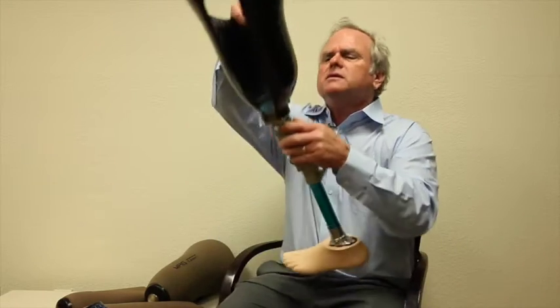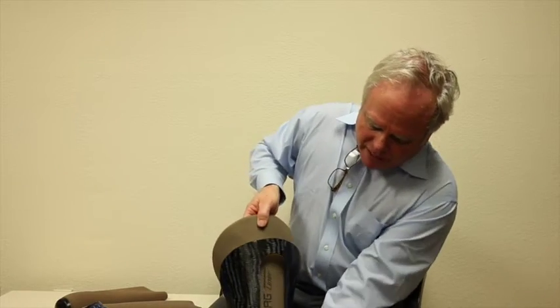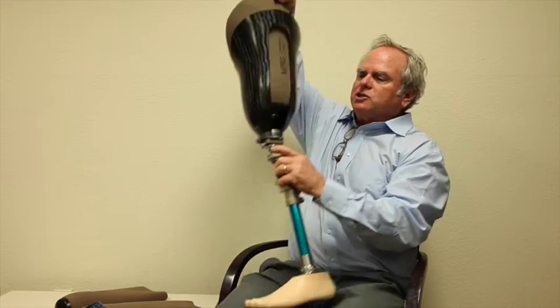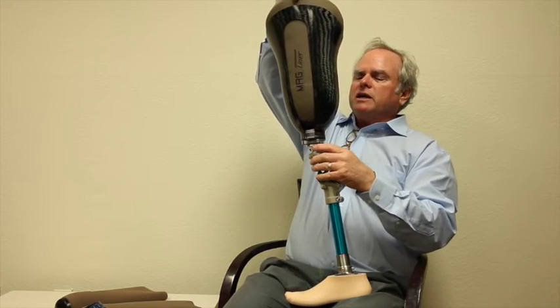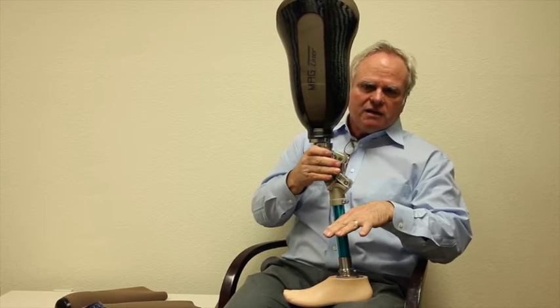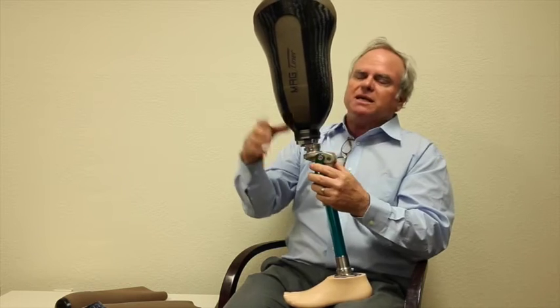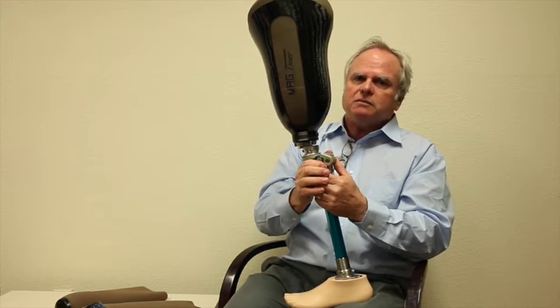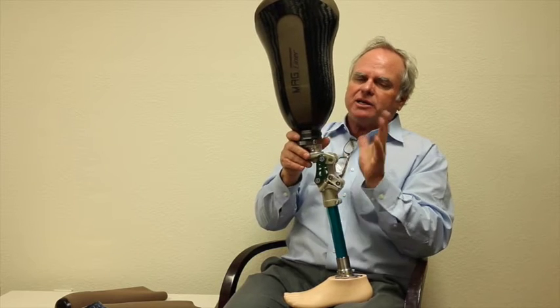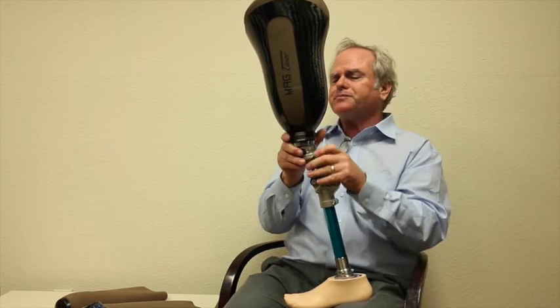I'm going to put this one on the unlock position. I'm going to put this liner in here, and if you'll watch, I'm going to put it just rested in here. Now, listen, I'm turning it on. Did you hear it click? Hopefully you could see it pull down that last bit. That 90 pounds of magnetism can help pull them into the socket. But don't count on that, okay? Make sure you hear metal before they stand. You hear the metal click, it's safe to stand, okay?